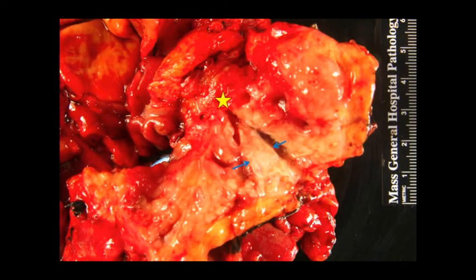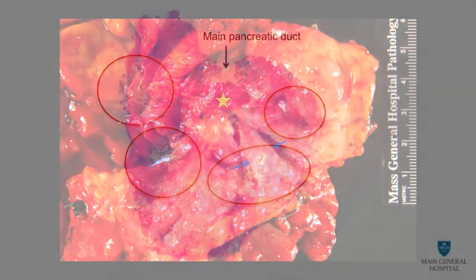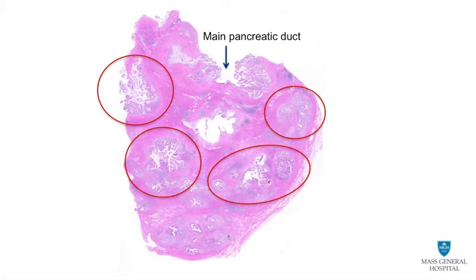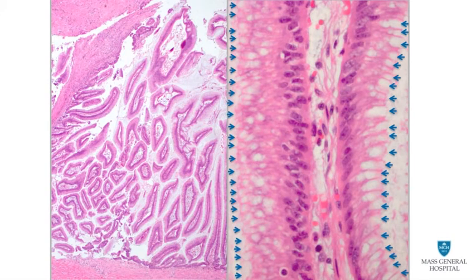Gross examination of the resected pancreas shows marked dilatation of the main pancreatic duct, marked by blue arrows, from the resection margin to the ampulla, marked by an asterisk. Typically, the pancreatic tissue showing gross abnormality is completely submitted for microscopic examination. A representative microscopic section shows that not only the main pancreatic duct but also many of its branches are dilated with papillary epithelial proliferation, indicated by red circles. Higher power magnification shows that the duct lining is replaced by villiform epithelial proliferation, with tall columnar cells with elongated nuclei with stratification and mucin in the apical aspect of the cytoplasm, marked by blue arrows.